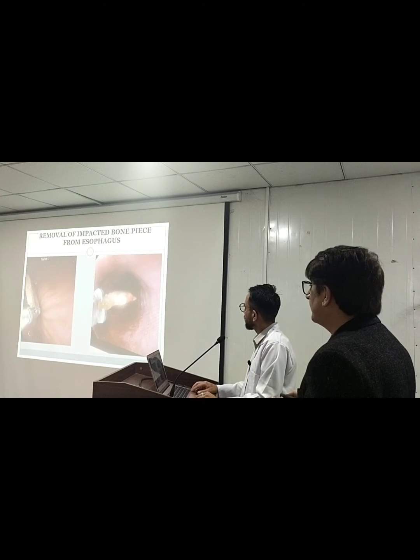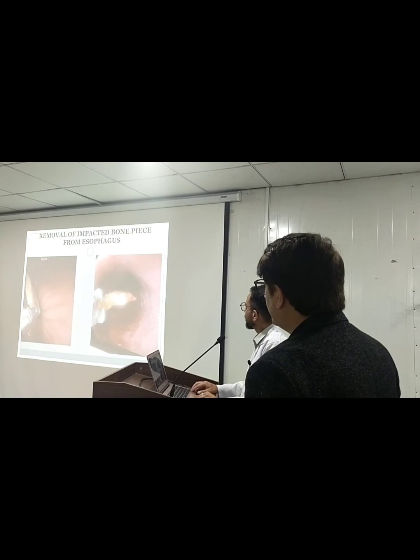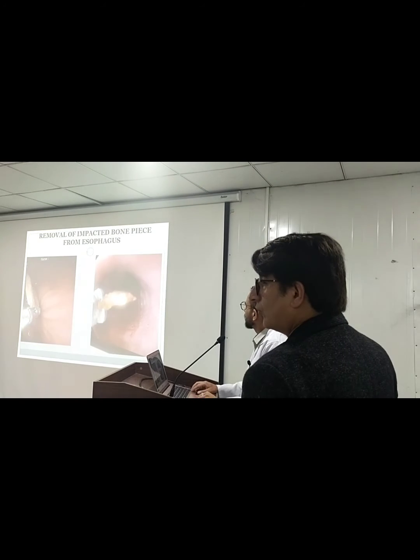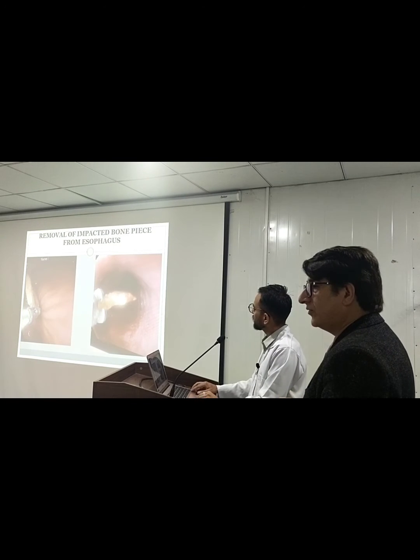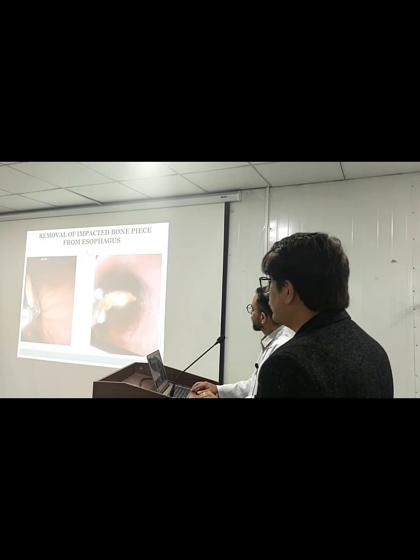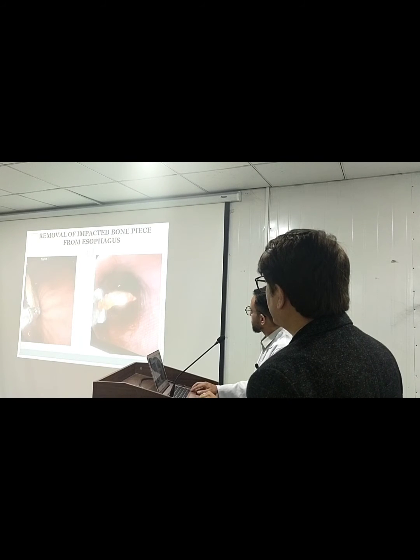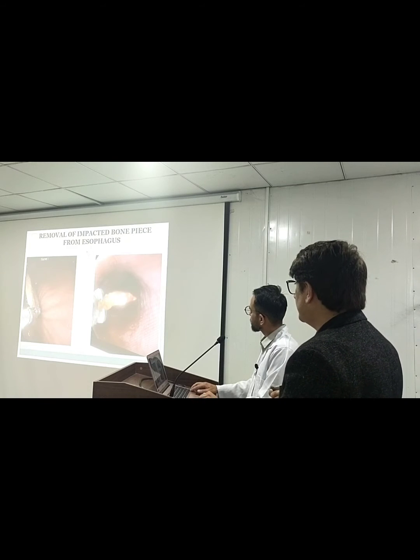If it's sometimes not possible, then with the meat boluses we usually push them down to the stomach for the ease of the patients. You can see usually patients have underlying strictures, sometimes ulcerations and narrowings. So we take the biopsies to rule out any underlying esophageal causes, any eosinophilic esophagitis. Sometimes some infections can lead to these strictures and narrowing of the esophageal lumen.